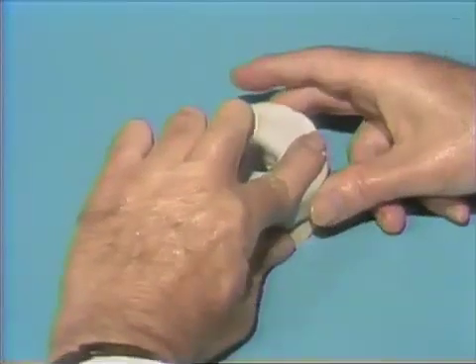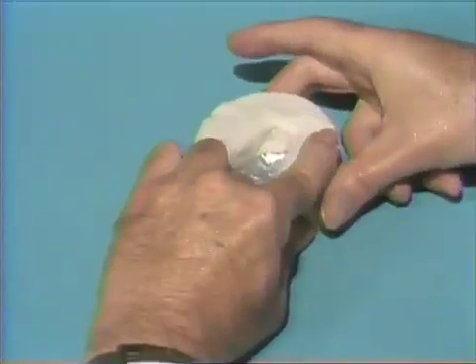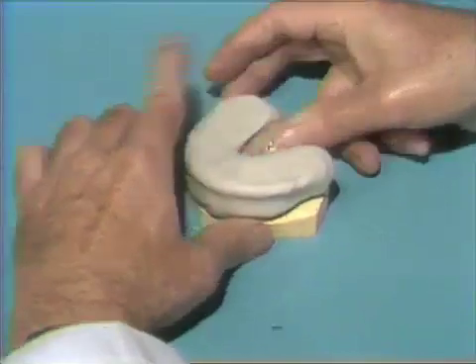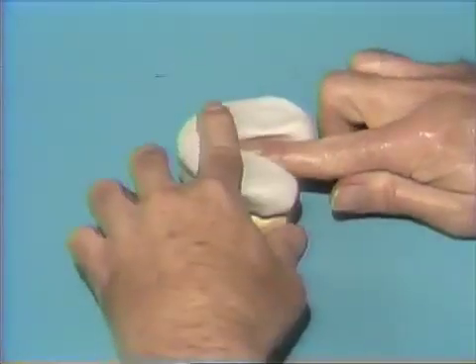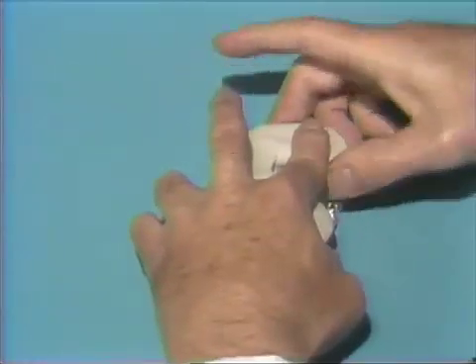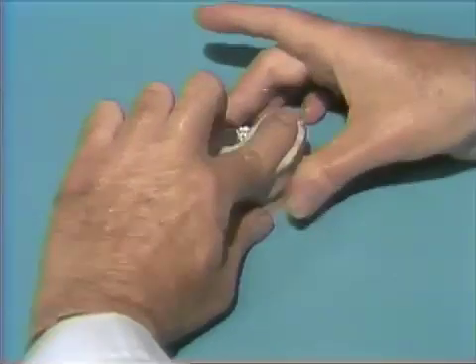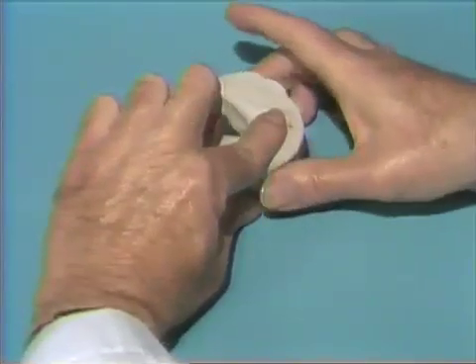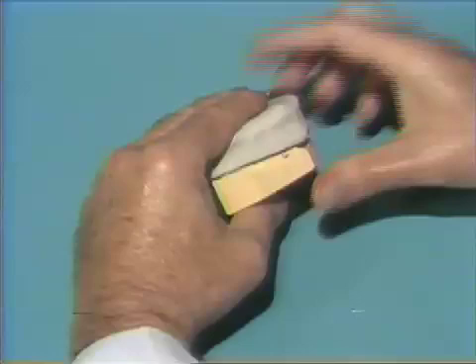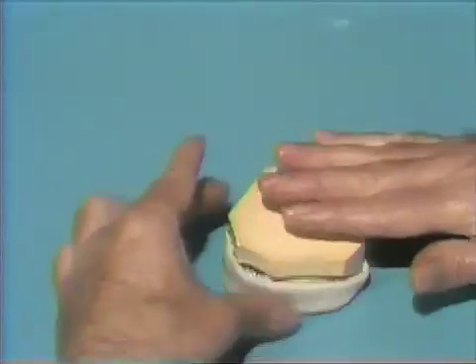We can continue to manipulate the tray until it begins to polymerize. We can also use a lab knife and trim away some of the skirt while it's in this doughy state, which will save us some trimming on the lathe later. The more trimming we can do at this stage, the less time is going to be spent subsequently on the lathe with a fast-cut stone contouring things down. We'll continue to move around and get the desired flange with finger action, and then take a lab knife and trim back some of this border so it requires a little less trimming later on.